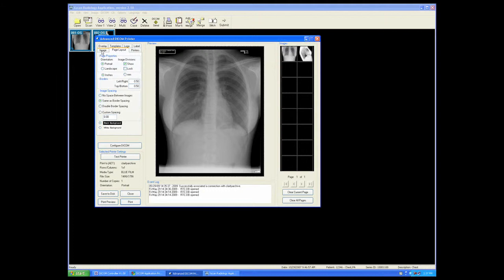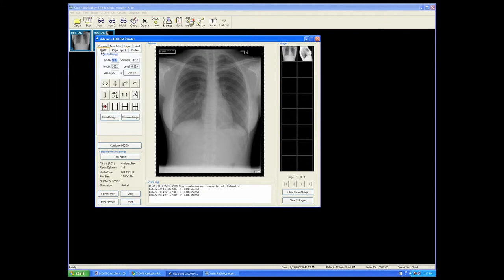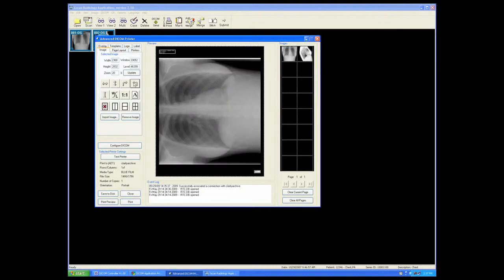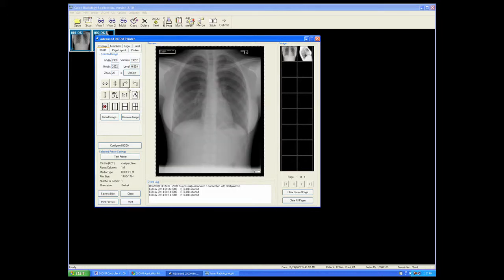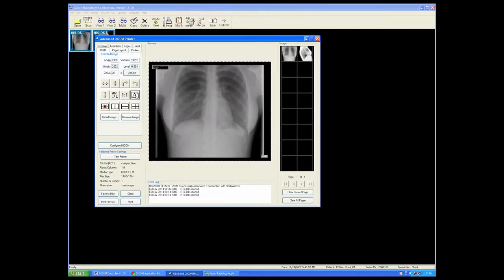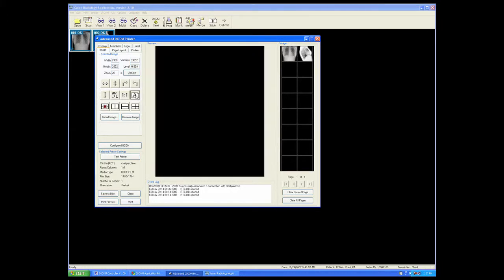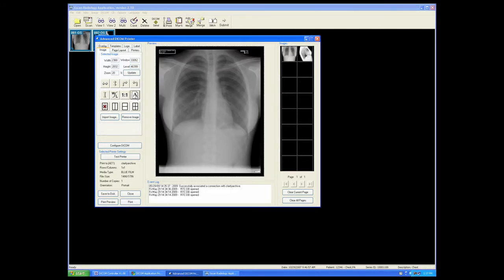We can also orient the image, choose landscape or portrait mode, segment our printer for multiple images.